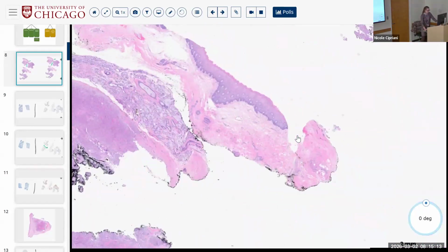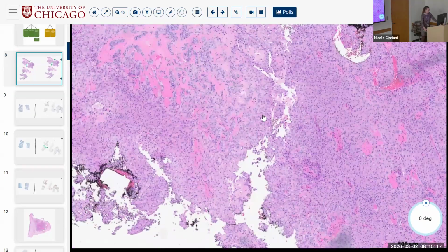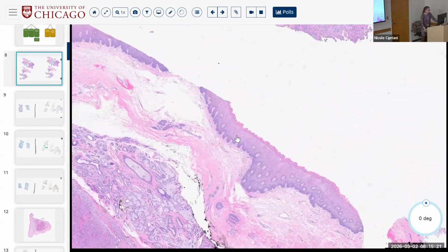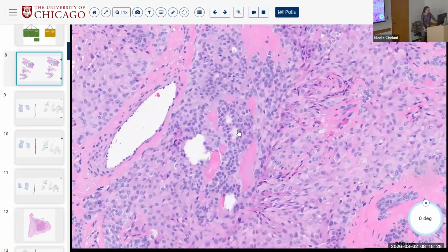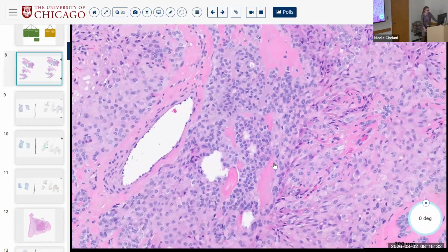So we have a very cellular tumor. We have hyaline or plasmacytoid myoepithelial cells. We have some hyalinizing stroma in the background. And we have these areas where we may ask ourselves, okay, there are some holes, right? Are these true ducts, or are these just sort of holes?